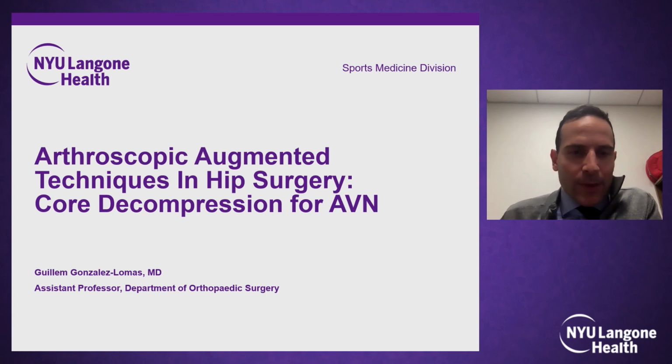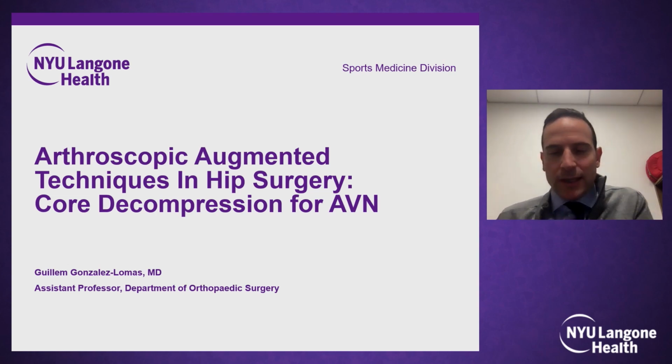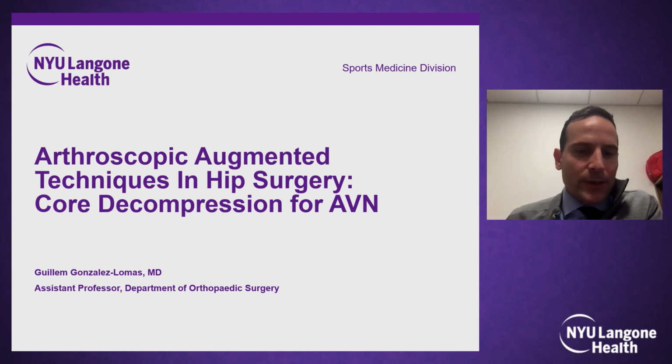So I want to make this talk pretty straightforward. We've seen now the panoply of conditions that arthroscopy can treat, and this is just another one of those. And I think what's unique about it is the thought progression that has gone on from its initial inception to what we are potentially able to do now. And actually, I'll mention that at the end, but Dr. Youm has been instrumental in developing instrumentation for this, which I think makes a lot of sense. So let's get right to it.